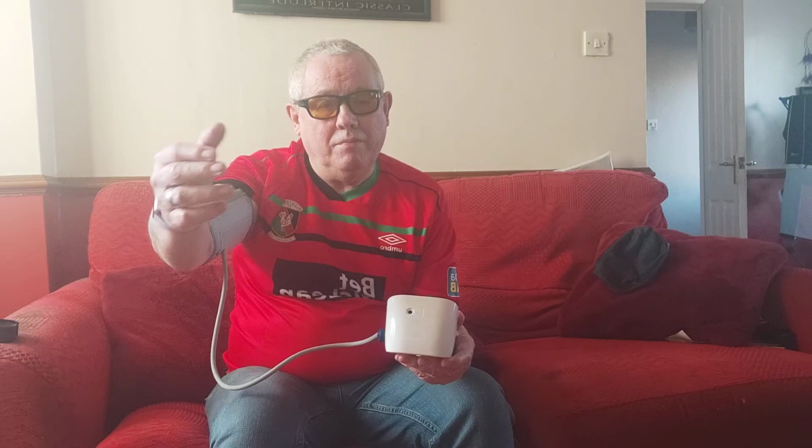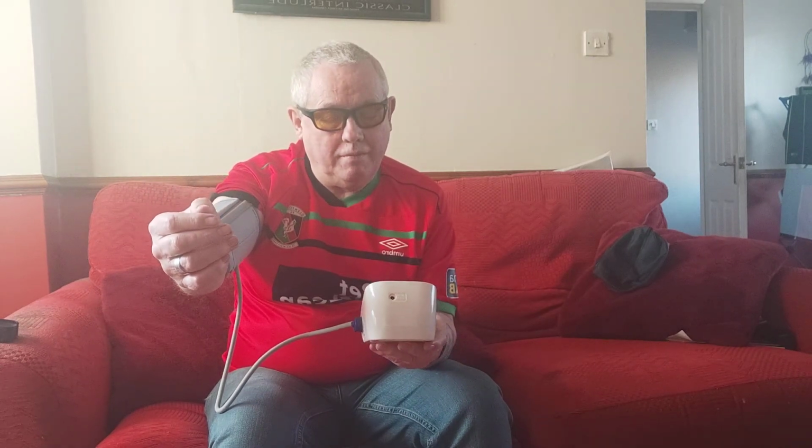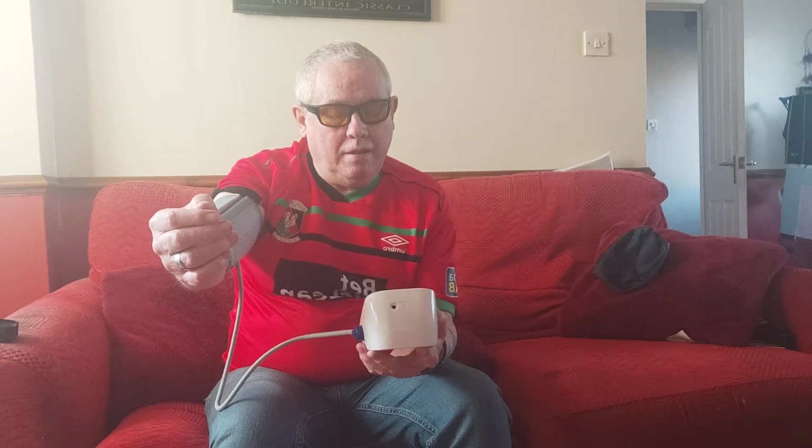So here we go. Arm up. You don't have to, you can have your arm down like that, you can have your arm up like that, that's your choice. But here we go, press start, right? Now off we go.